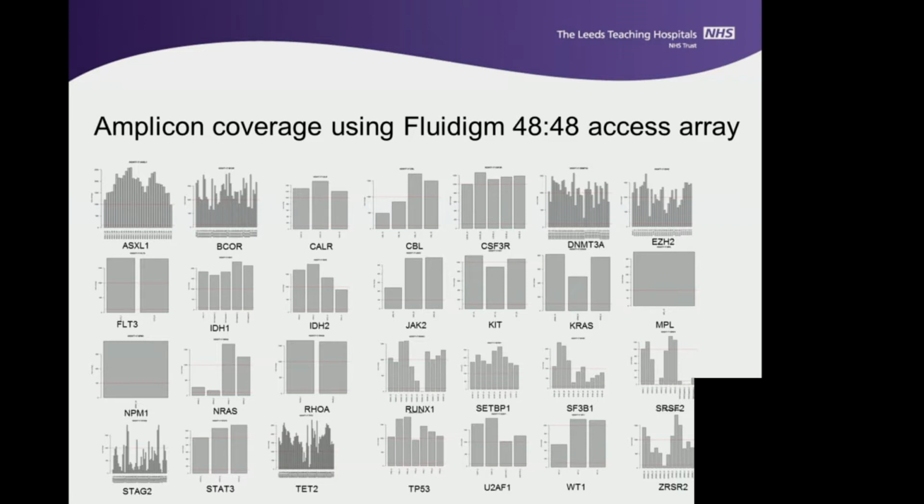Again, SRSF2, you can see here, we're looking at a single hotspot, but you can see we've got multiple amplicons at base also. Because it doesn't perform very well, we've thrown 4 or 5 different amplicons on it with a view to try and get the best coverage we can.